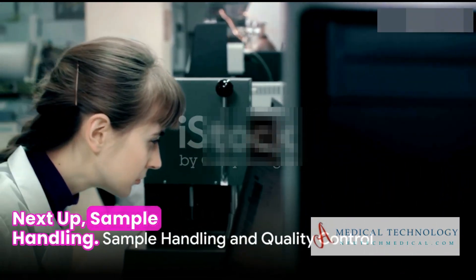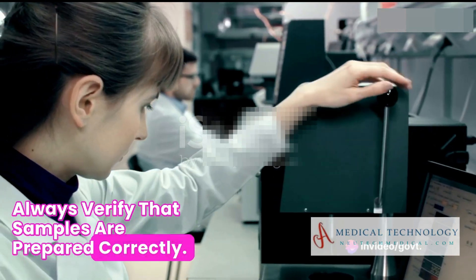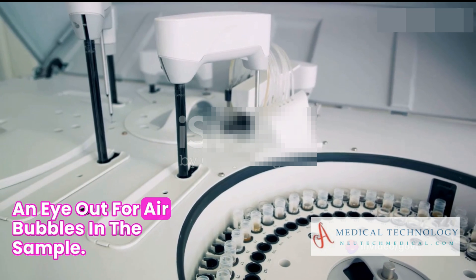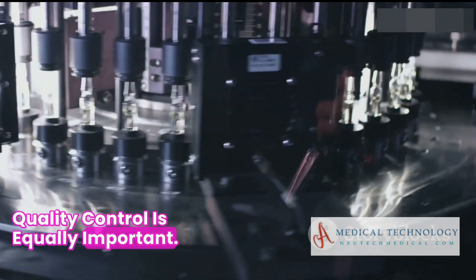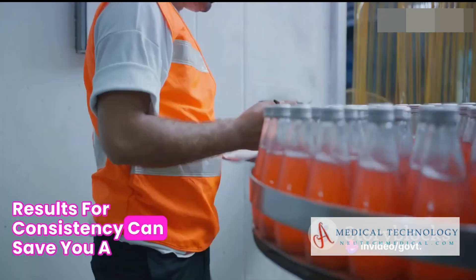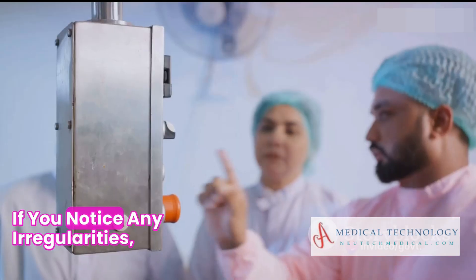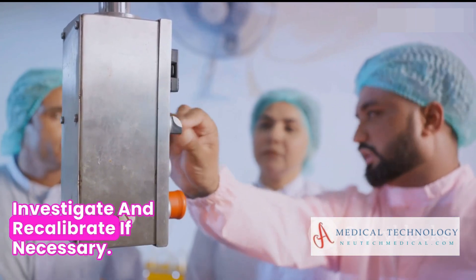Next up, sample handling. Always verify that samples are prepared correctly. Check for the proper tube size and mixing, and keep an eye out for air bubbles in the sample. Quality control is equally important. Regularly running quality control samples and monitoring results for consistency can save you a lot of headaches down the line. If you notice any irregularities, investigate and recalibrate if necessary.